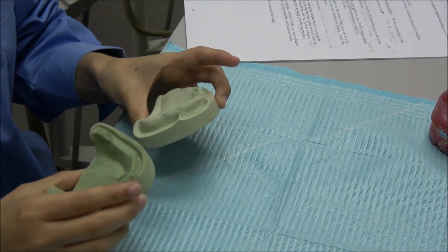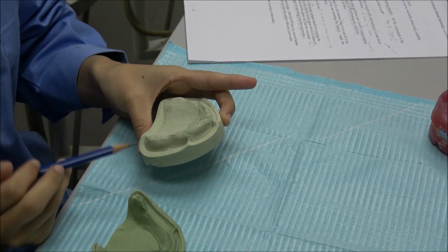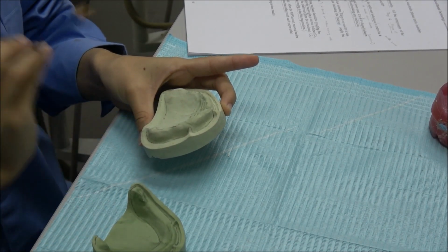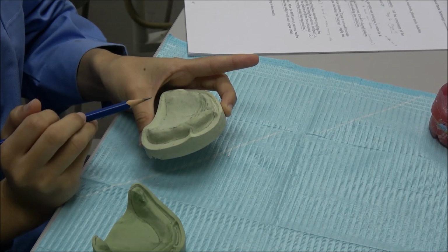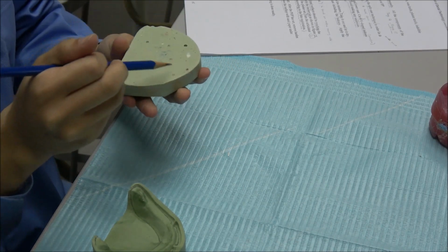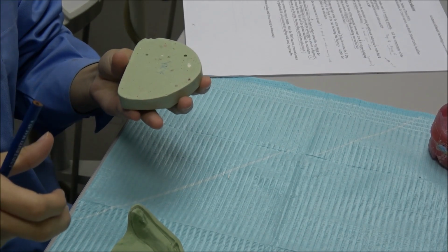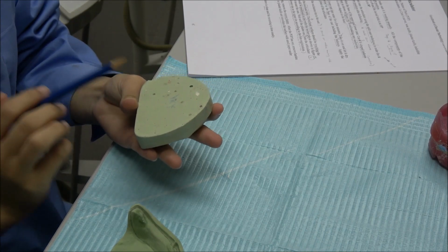Before we start everything, we have to make sure, because I see a lot of students have a lot of wax around the model. So make sure you wash the wax off your model under hot water. Okay, if there is any wax here, it will make your mounting not stable, your mounting will come up. So you must pay attention to this.